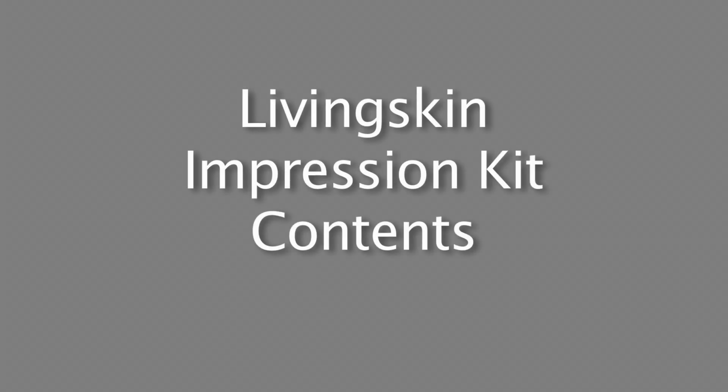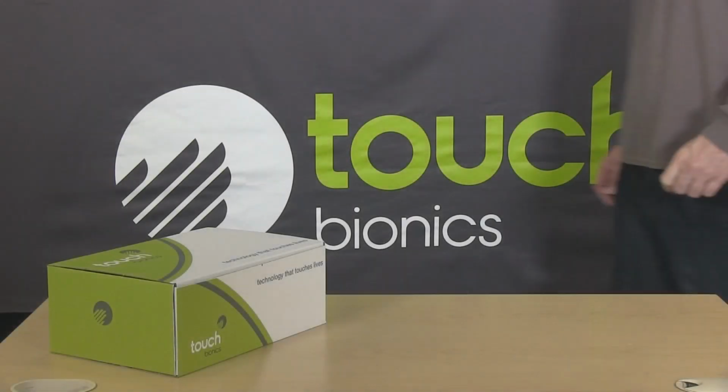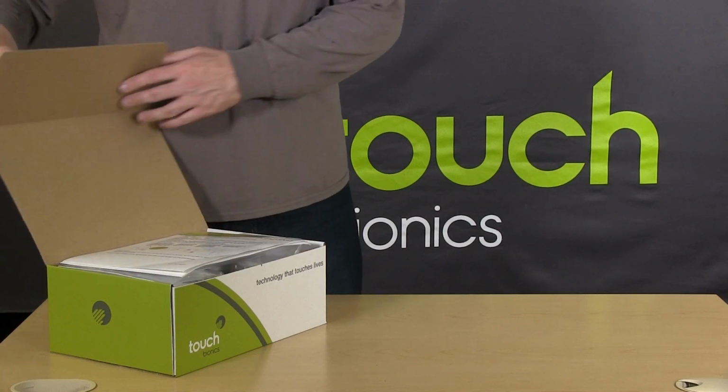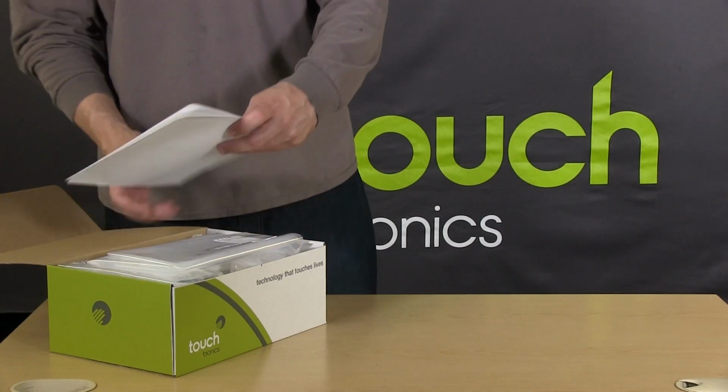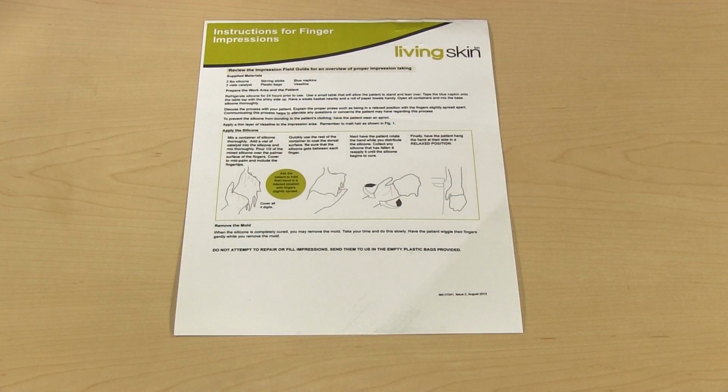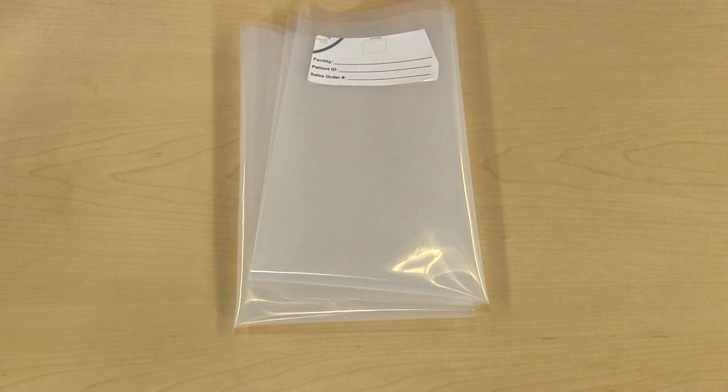In this video, we will review the contents of the Livingskin impression kit, which includes everything you need to create an impression for a Livingskin prosthetic device. Inside, you will find detailed instructions which you can reference in addition to the video tutorials if you have any questions. A labeled shipping bag for return of the impressions to Livingskin.